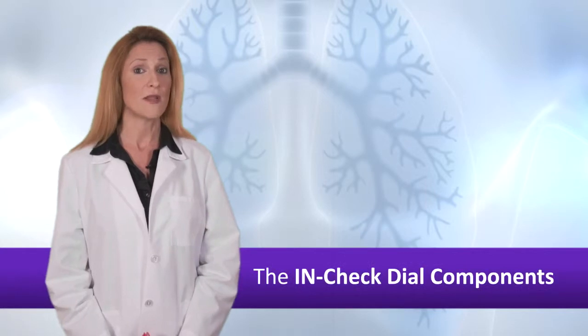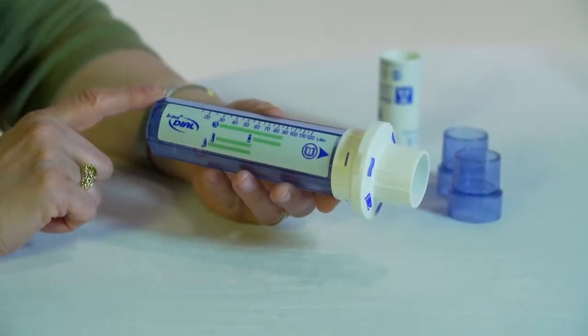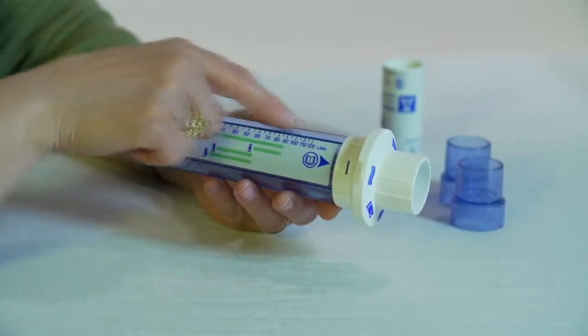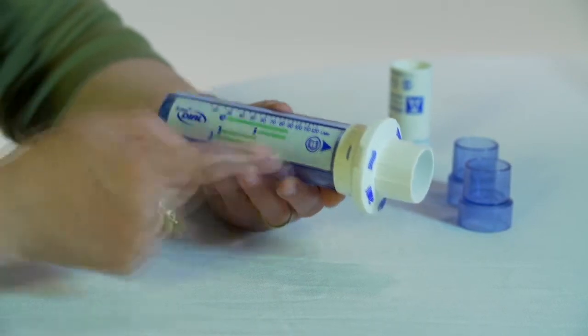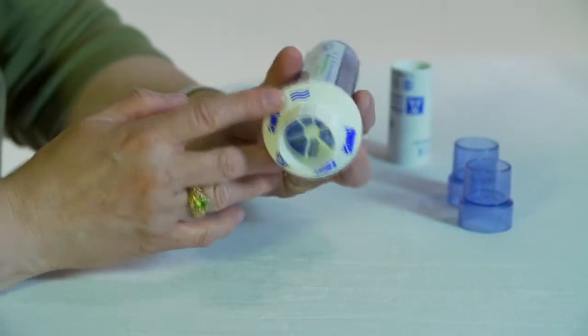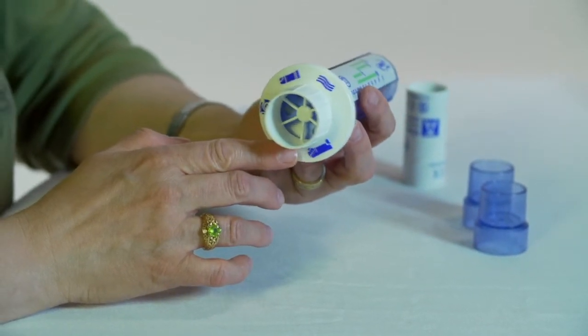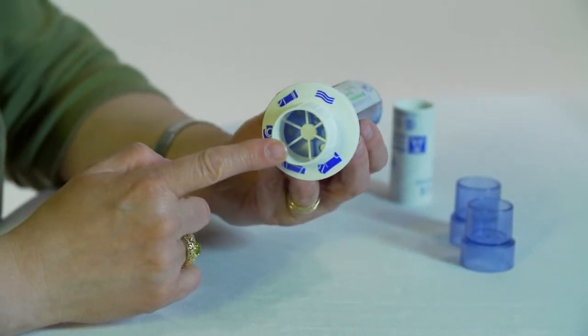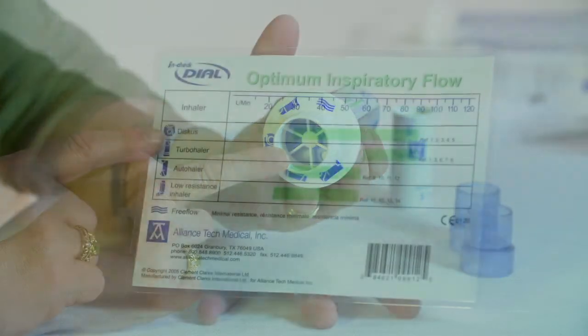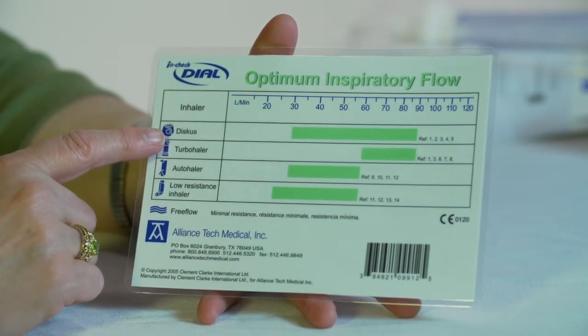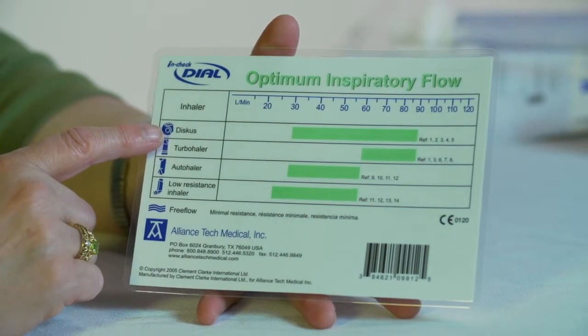The InCheck Dial has three main parts: an inspiratory flow meter, which is in the long clear tube portion, a rotating dial that sets the airflow resistance for the various devices, and a place to insert a mouthpiece. A sterilizable mouthpiece is included. One can also purchase disposable mouthpieces. The device also comes with a card showing optimal flow ranges for various devices.